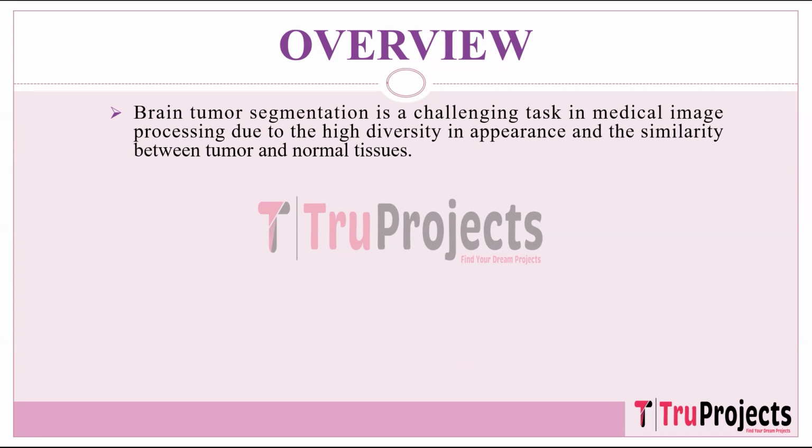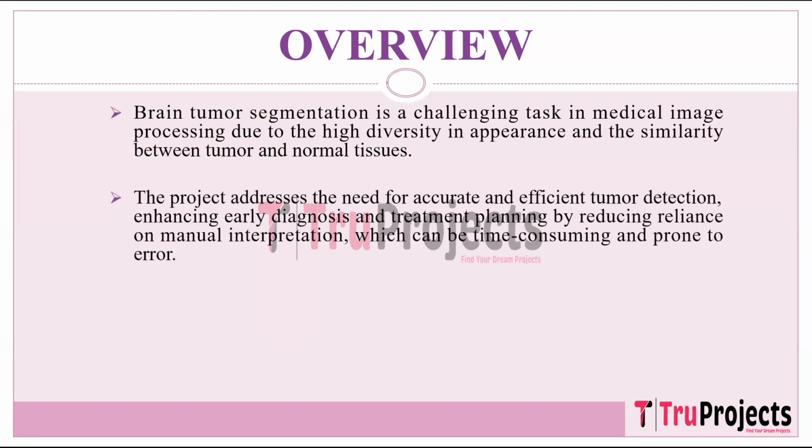tumor and normal tissues. Tumors can exhibit diverse shapes, sizes, and textures, making it hard to accurately distinguish them from healthy brain tissue. The project aims to improve tumor detection accuracy and efficiency, reducing reliance on time-consuming and error-prone manual interpretation of medical images.